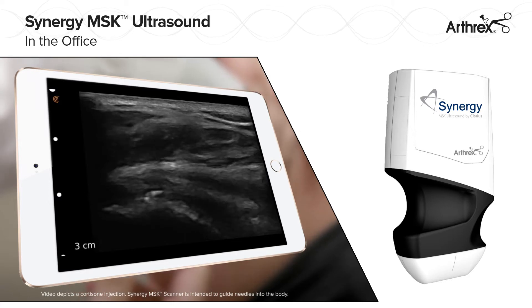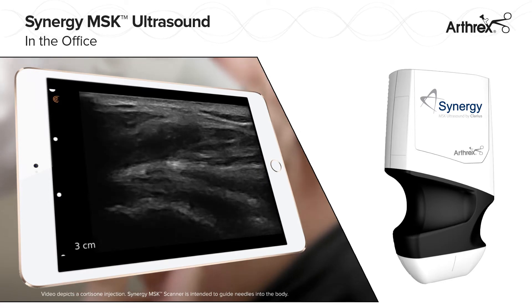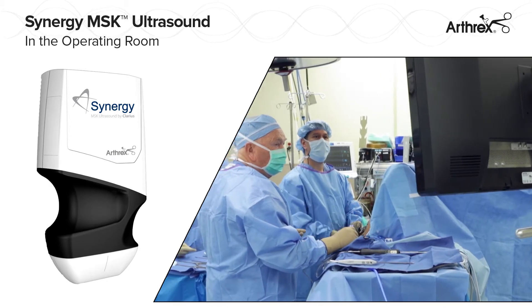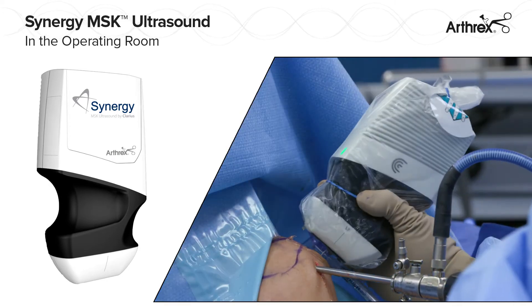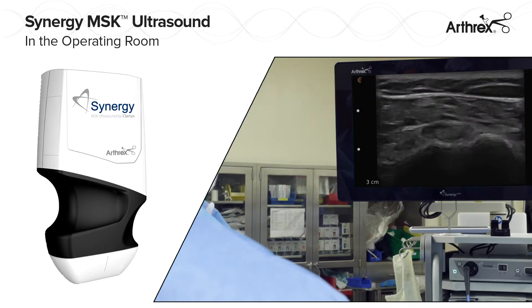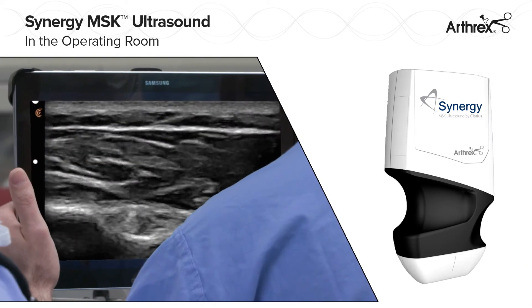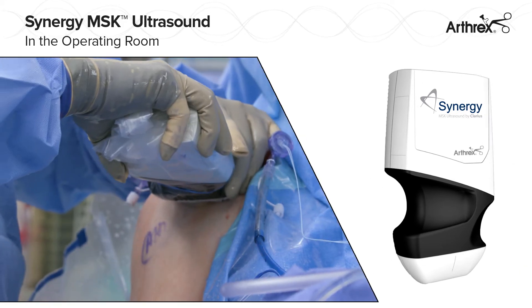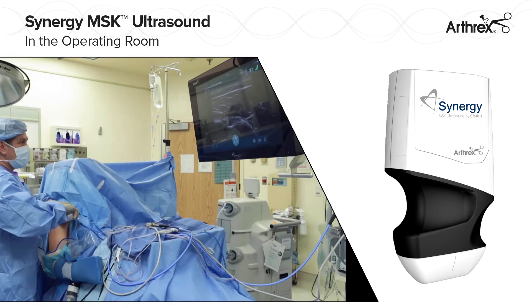The metal-encased wireless design provides the freedom of portability from the office to the OR. The Synergy MSK Ultrasound is easily draped for use in the OR to locate loose bodies, image superficial anatomic structures, and provide precise guidance of soft tissue repairs such as biceps tenodesis, MPFL, and ALL.